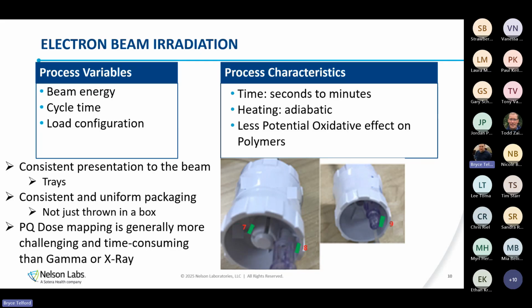The other thing is the dose delivered itself is going to be different. We might have a minimum sterilization dose of 25 kilogray and a verification dose of only 8 kilogray. Those are two very different ranges. So between the different configuration and the different dose, we tend to have that additional dose map. So with electron beam, just keep in mind configuration and orientation matter, and for testing purposes, we likely are going to need that additional dose map.